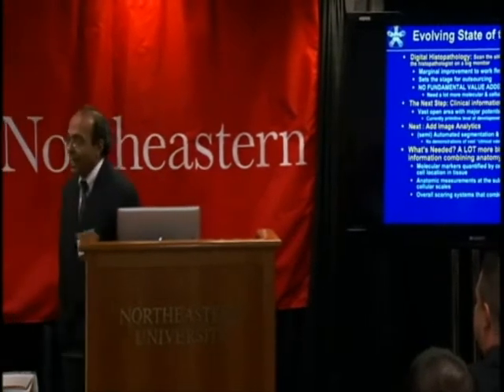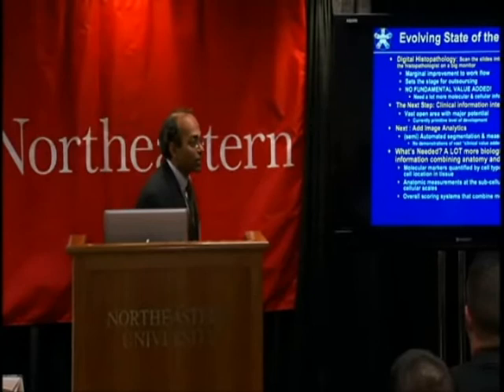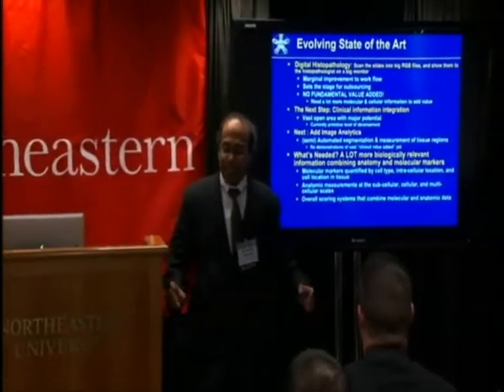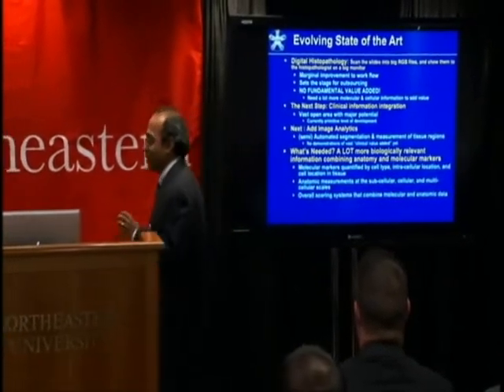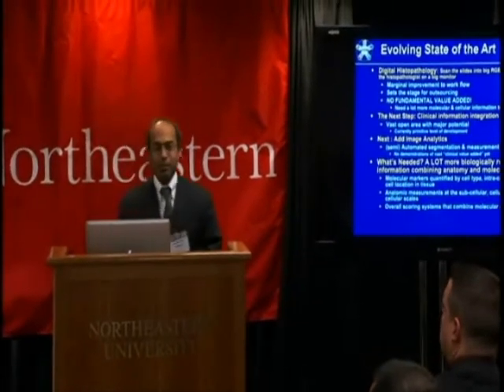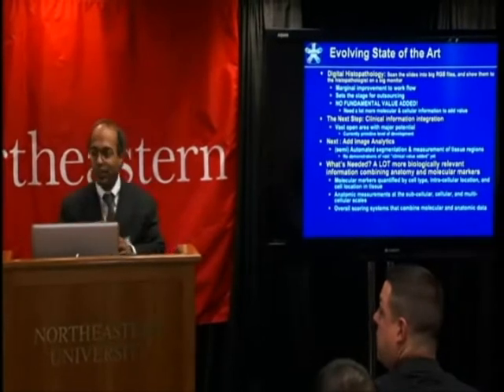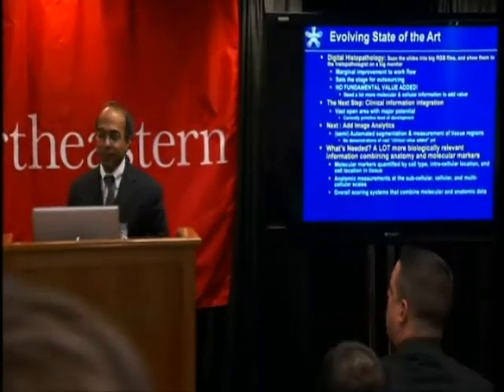Since imaging still rules, people said, okay, can we improve the state of the art? And so one thing they started doing is building scanners, RGB scanners. This is the whole field of digital histopathology, as advertised right now by the major companies. Basically, you've gone from staring through a microscope to staring at a screen, but the fundamentals haven't really changed.